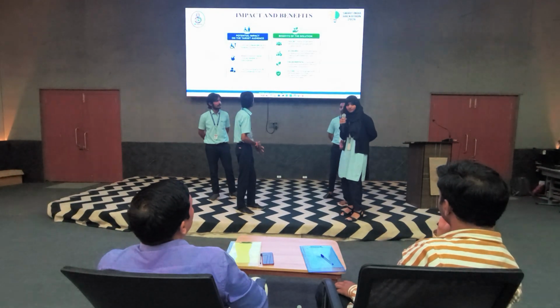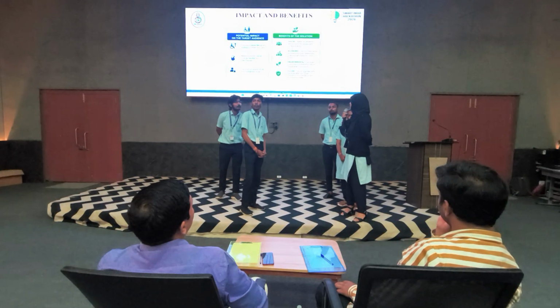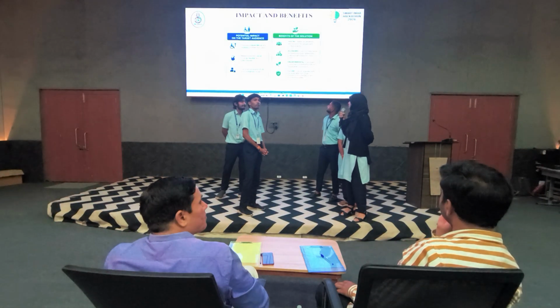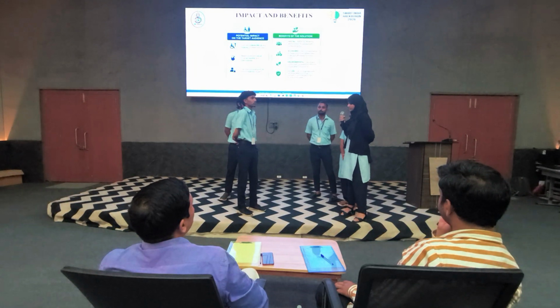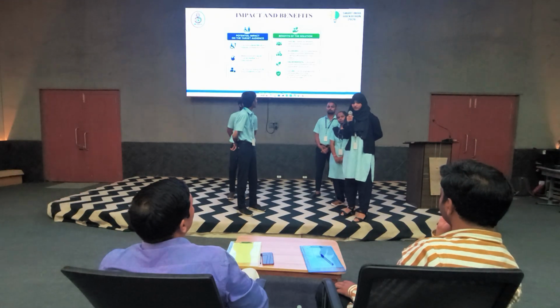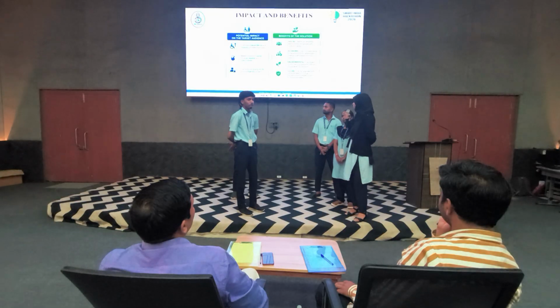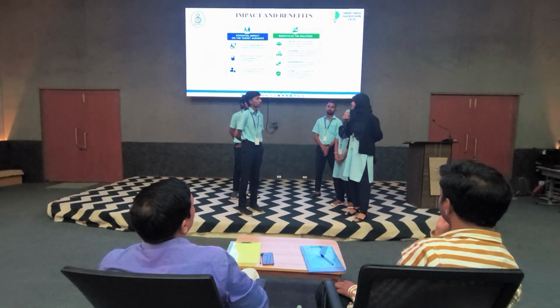As I already said, our main agenda is to make the patients move freely and independently. The potential impact on the target audience is that we will improve their independence. They should be able to do everything themselves. They don't need any guide or helper to do whatever they want.